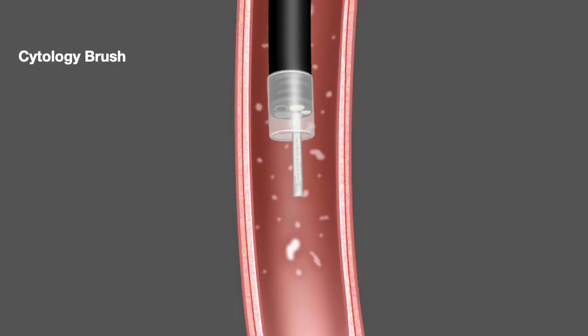Here is a cytology brush that has come out of the endoscope in a closed position. You open your right hand — that is the handle — the brush comes out, and it is in an open position. The endoscopist scrapes the lining. Let us take a minute to see the same action simultaneously: what happens in the operating field and what happens outside, side by side.